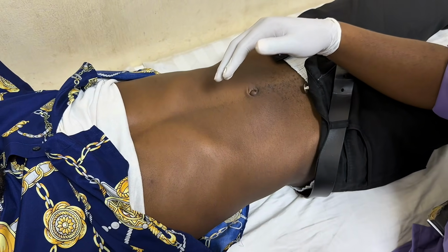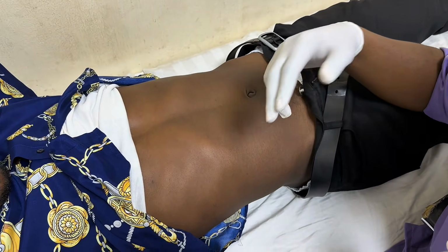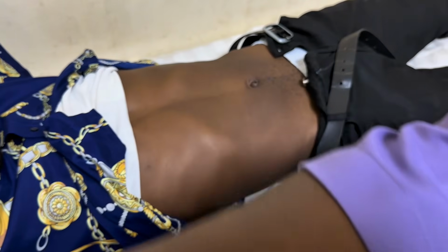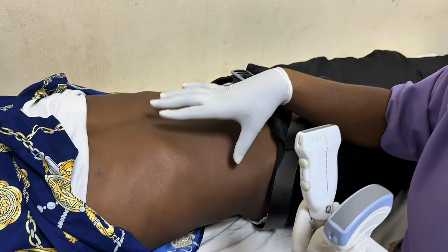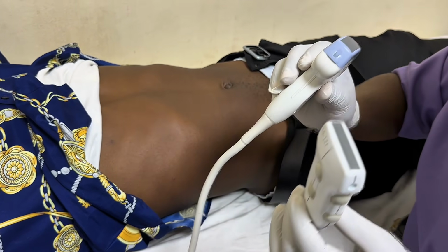So I'm going to be using two different types of probes. I'm going to be using the curvilinear probe, this one, and I'm going to be using the linear probe also. This linear probe is the best to assess bowel loops, while this one is just to get deeper structures.